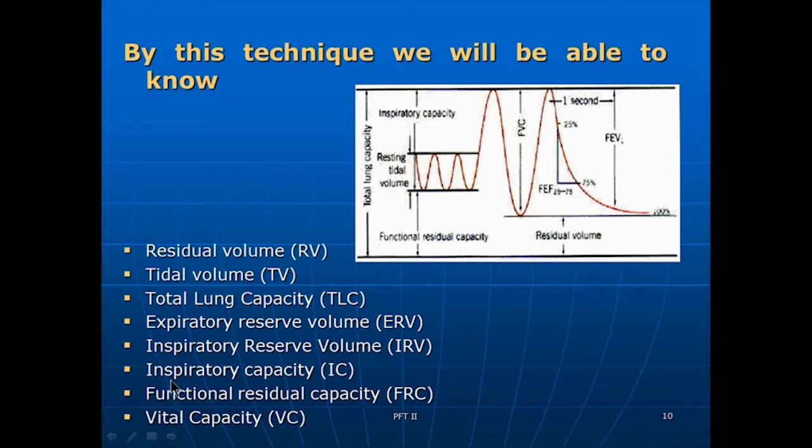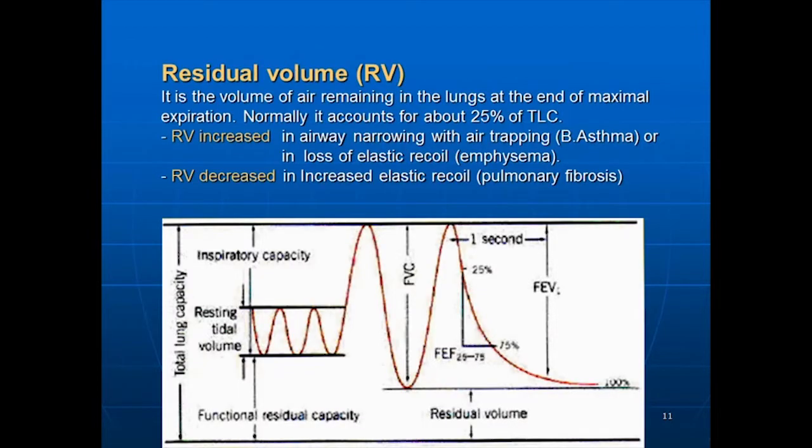So these are the ones that were traditionally learned in pulmonary physiology, all the normals and the abnormal values in their lung capacities and their volumes. So when we look at someone who needs to have a pulmonary function test, we looked at the first part, which is spirometry, looked at their flow versus volume. Did they have good flow but low volumes? Restrictive disease.